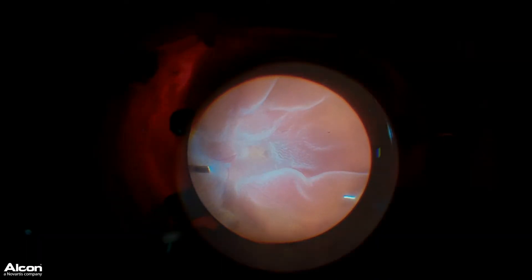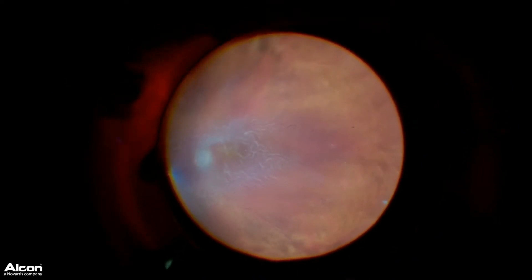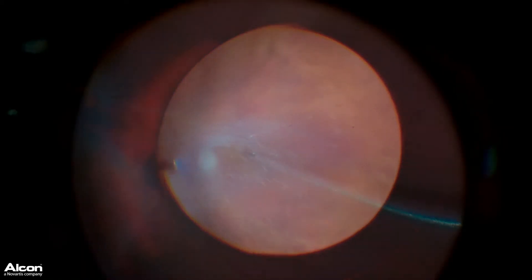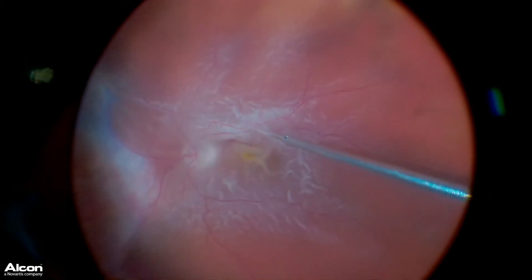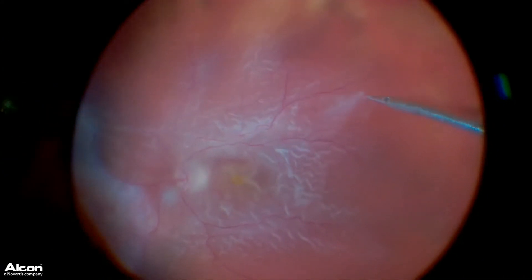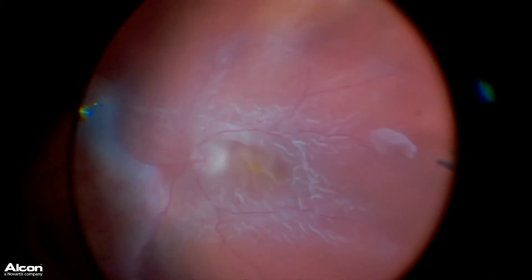What we did that was so unique in this case is we drained his retina flat utilizing a guarded external needle technique. This is a 26-gauge, 3/8-inch needle. By elevating the pressure with the infusion, we were able to drain that retina flat, which makes it much, much easier to peel this scar tissue off the surface of the retina.